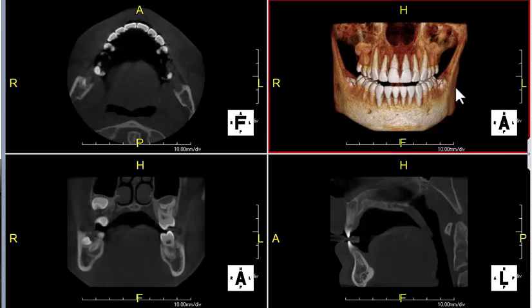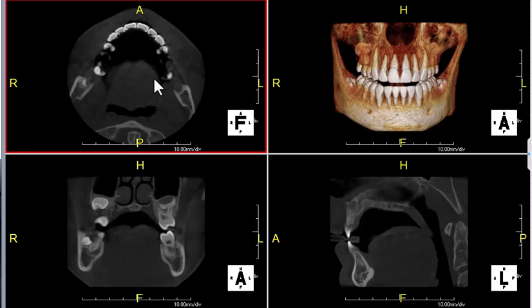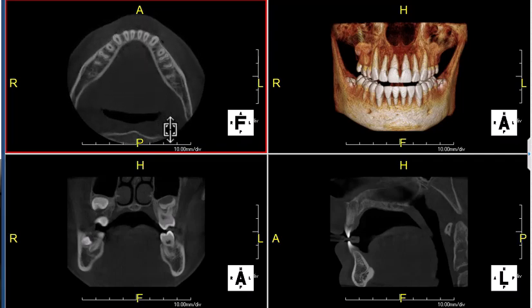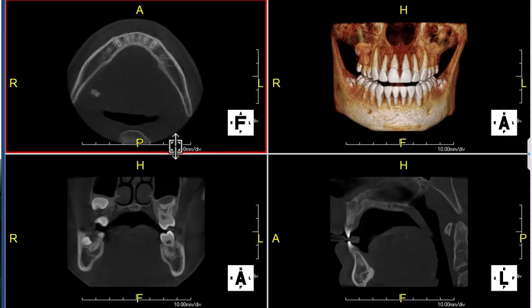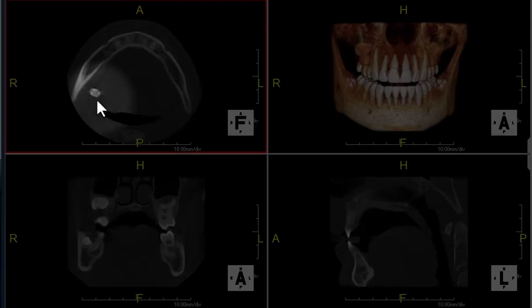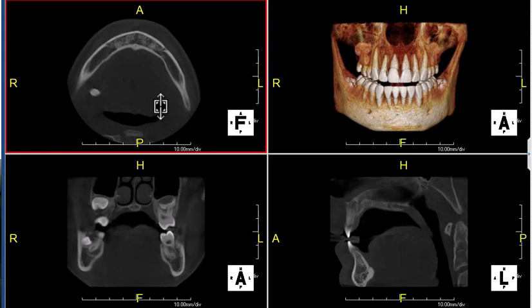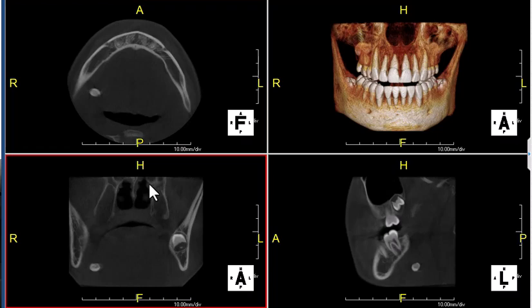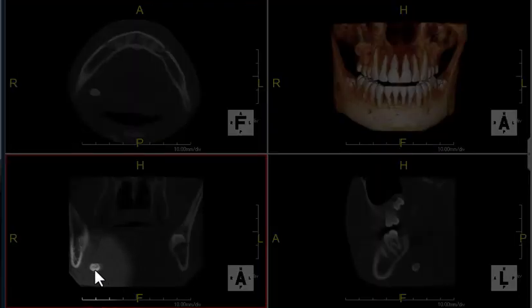Now we're turning to the slices on the three-dimensional CBCT. The first one I'm going to look at is this upper left-hand side here, and I'm just going to scroll down, looking to see where this radio opacity is. As you see, it clearly comes into view right here on the right-hand side — very distinctly. Anatomically, that is in the floor of the mouth, the submandibular gland — the body of the submandibular gland.